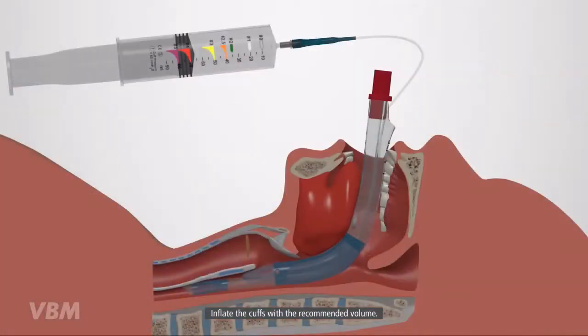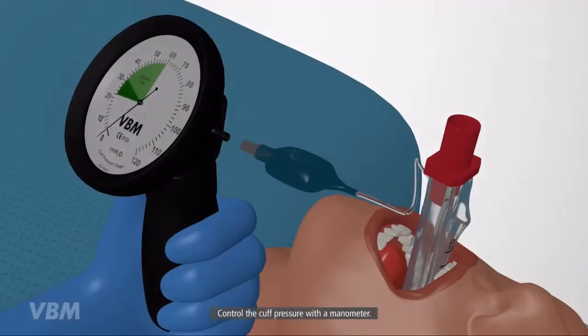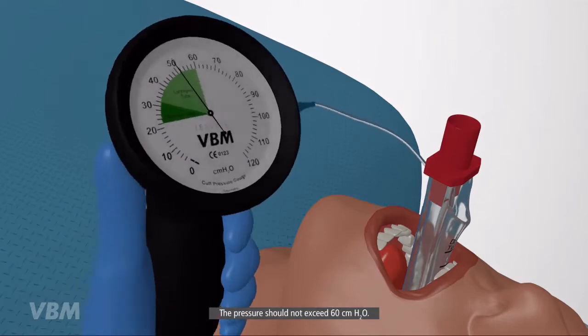Inflate the cuffs with the recommended volume. Control the cuff pressure with a manometer. The pressure should not exceed 60 cm H2O.